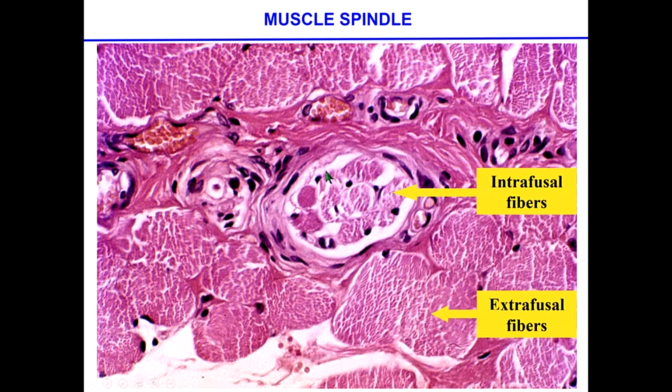Okay? So even if someone were to be nasty to you and show you just the intrafusal transversal section in an exam, and say, what kind of muscle is this one? You could immediately say that this, because of the location of the nuclei, is a skeletal muscle. All right? I'm not that nasty, so don't expect something like that from me for the exam.